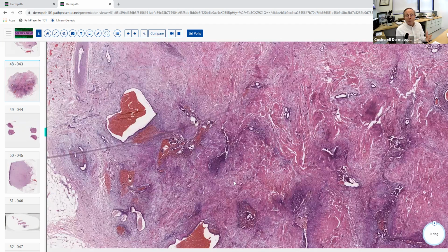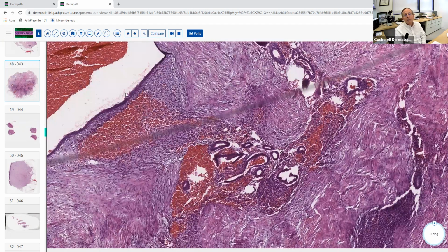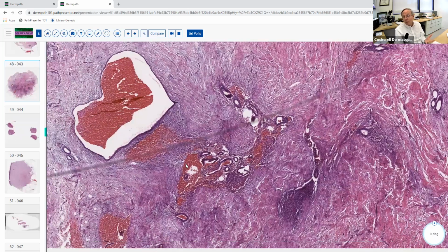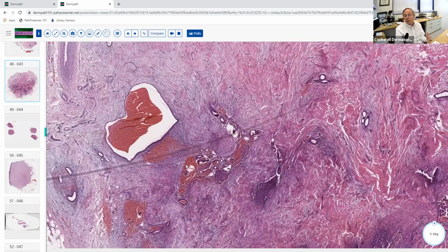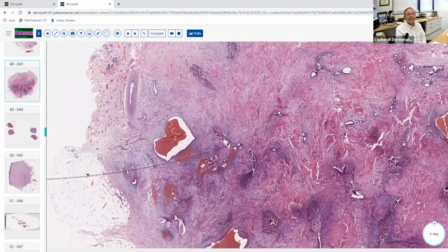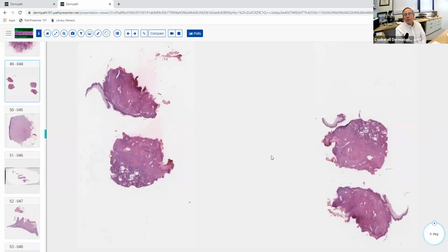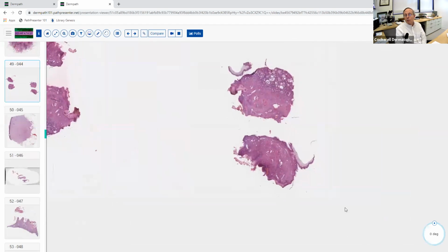This is ectopic endometrial tissue, and it's commonly seen in a setting like this. It's often seen in the lower abdomen of a younger woman, usually when they're still menstruating. And so you can actually see, this is sort of analogous to what goes on in the menstrual cycle. You get the shedding of the endometrium and erythrocytes in there. So this is really what an actual endometrium would look like if you took a biopsy of a lady's uterus who was in a menstrual stage. So that is cutaneous endometriosis. You probably won't be encountering that on the exam, but still, you've learned about it.